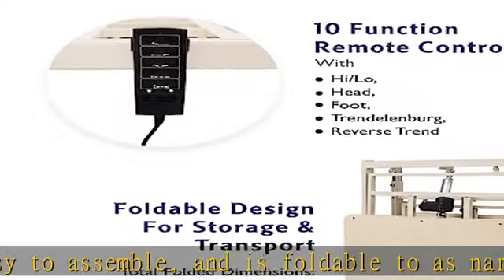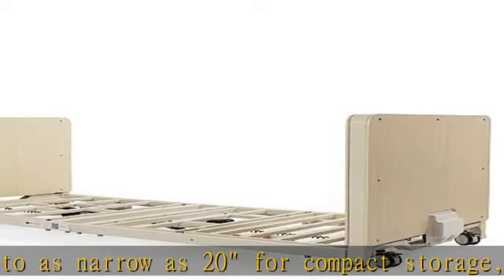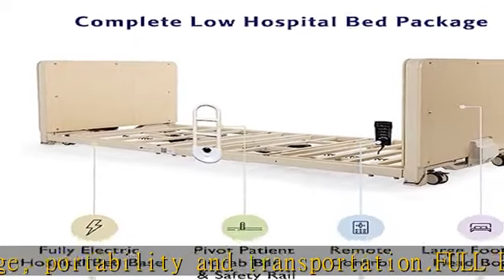Bed specs: the split frame deck measures 80 x 36 inches and can be used with most standard size hospital mattresses. It has a high/low travel height range of 3.9 to 25 inches.